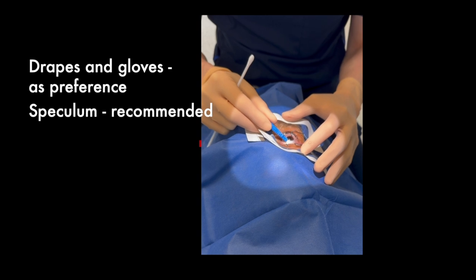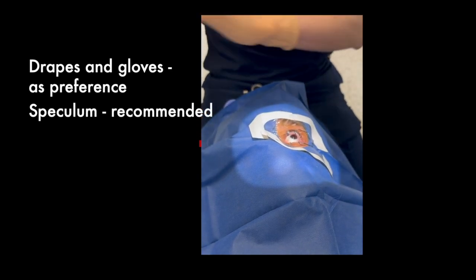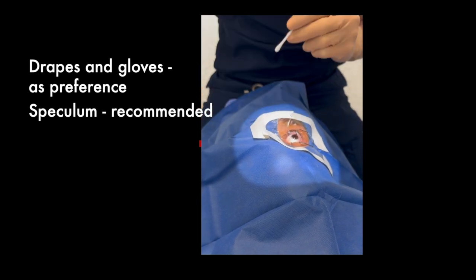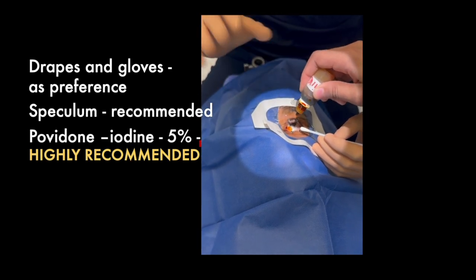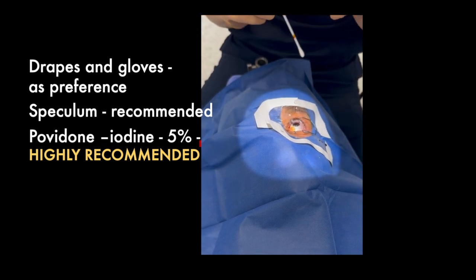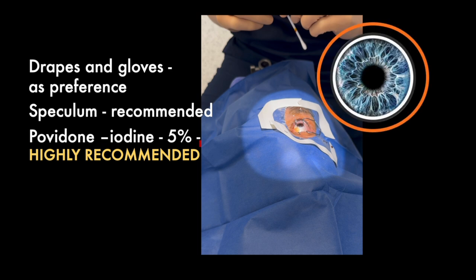Now, to know the distance where you need to apply the injection, which is 4 mm from the sclerocorneal limbus, you can use an empty trocar handle or a soft cotton tip applicator. It is highly recommended to apply another drop of 5% povidone directly in the site where you are going to inject, and wait at least 1 to 2 minutes. It has been observed that povidone can take effect within 15 to 30 seconds.